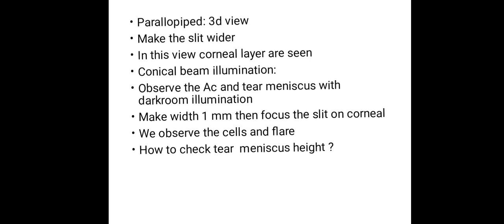For conical beam we will be keeping the slit at 1 mm, then focus the slit on the cornea. We observe the cells and flare.